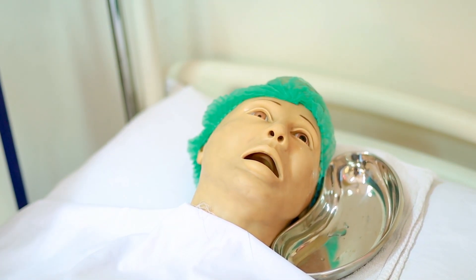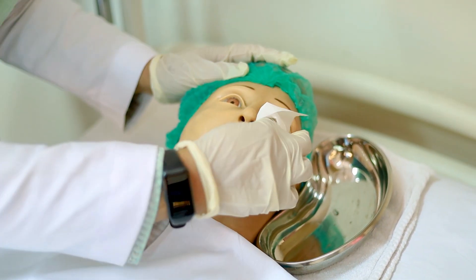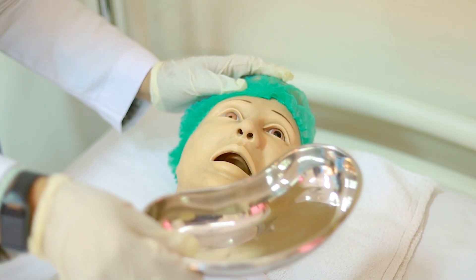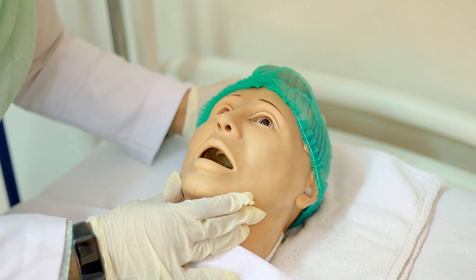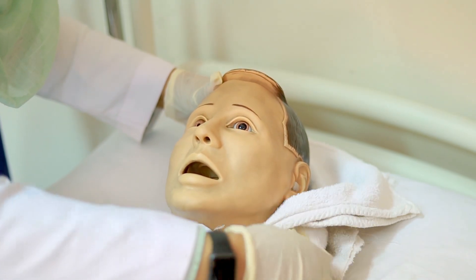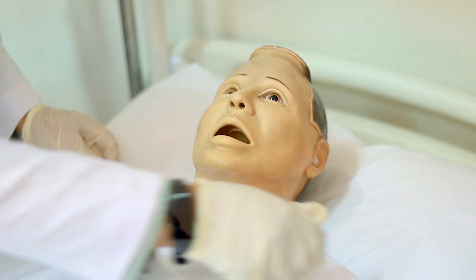Then I have to secure this. Once eye irrigation is done, we have to clean the patient's eye carefully and around the neck of the patient. We take the receiver back. Mr. Ali, are you comfortable? Are you feeling good now? Thank you. Then you can remove the cap, remove the towel, and make the client comfortable.